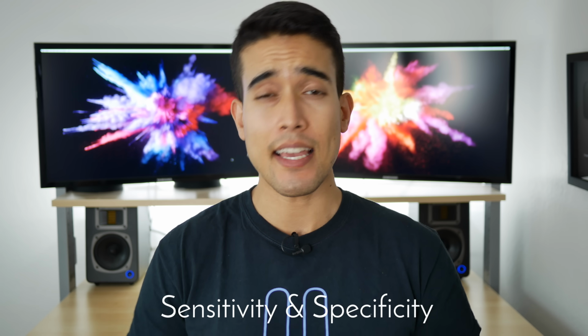No test is 100% perfect. A lot of the functionality and the effect of the Apple Watch is going to depend on the ECG's sensitivity and specificity. And a lot of what I'm going to say here is speculation because we won't really know until Apple enables the ECG function and we see a lot of people using this and have more data points.